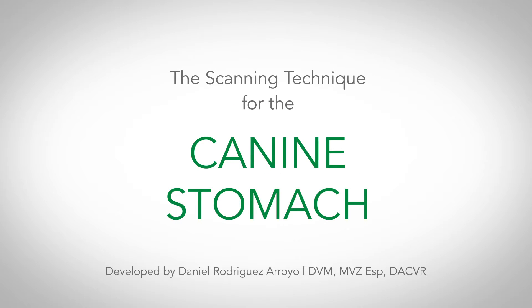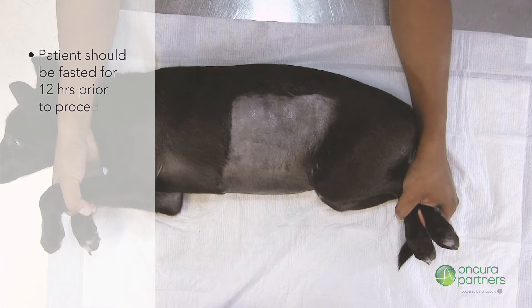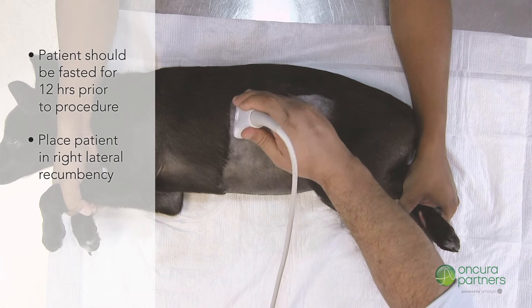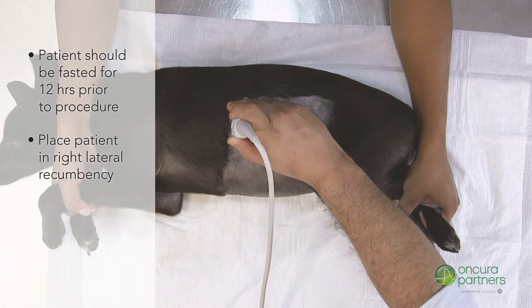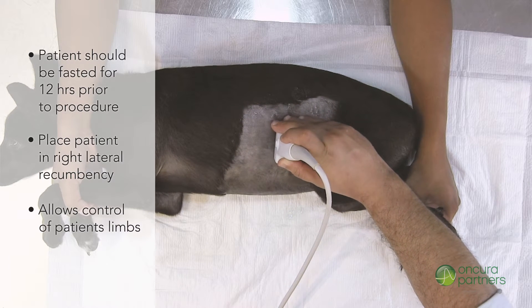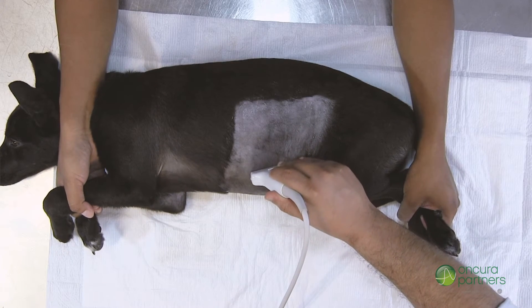The scanning technique for the stomach in lateral recumbent canine patients: before the procedure, it is strongly recommended that the patient be fasted for 12 hours. Place the patient in right lateral recumbency with their feet directed towards the sonographer. This position will allow one other person to have control over the patient's front and hind limbs.